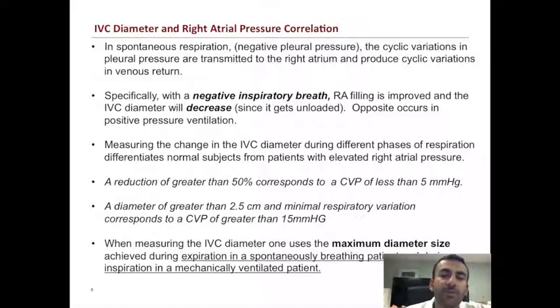So what you're looking for when you have a negative inspiratory breath, right atrium filling should actually improve, and your IVC diameter will decrease since it's getting unloaded. The opposite occurs when you have positive pressure ventilation. So essentially, either way, whether it's positive pressure or negative pressure breathing, the key thing that you're looking for is the different phases of respiration causing a change in the IVC diameter.